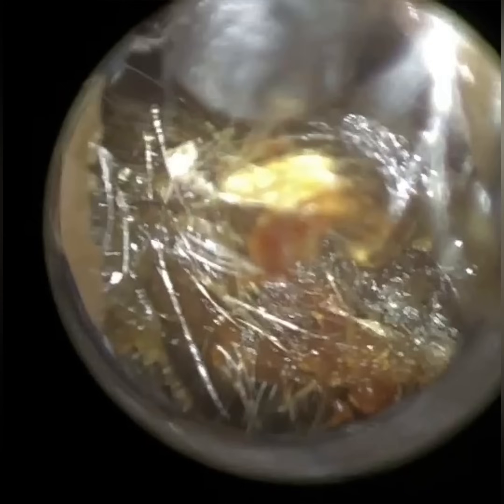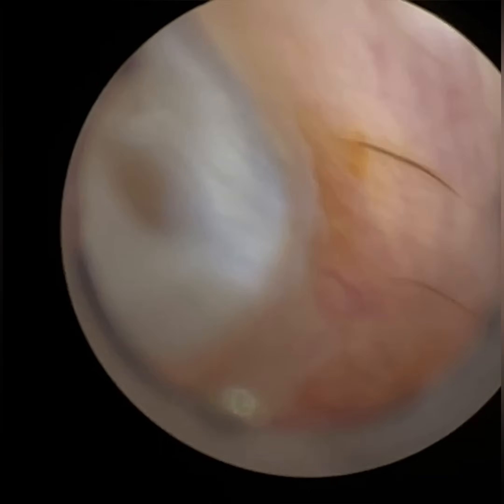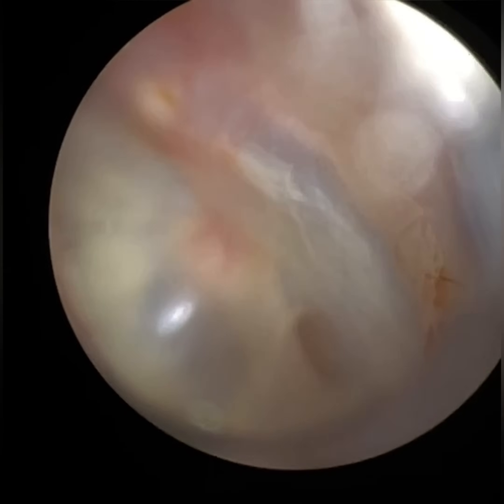We've developed, or are in the process of developing, our own range of instruments which are more efficient and easier to use with the Waxscope, but also helpful regardless of which visualisation method you're using — whether it's an ENT microscope, head loupes, the Waxscope, or the endoscope. That should be launched in the next couple of months. I managed to extract that using the earhook. I'm now visualising the eardrum, getting it in focus. You can see there's a bit of tympanosclerosis anteriorly — a slight thinning — so I've zoomed in to make sure there's no perforation.